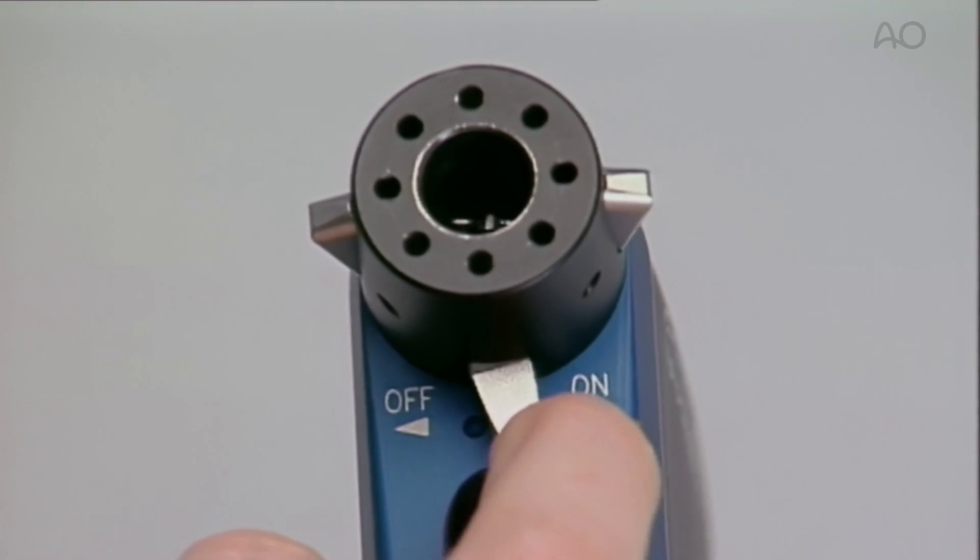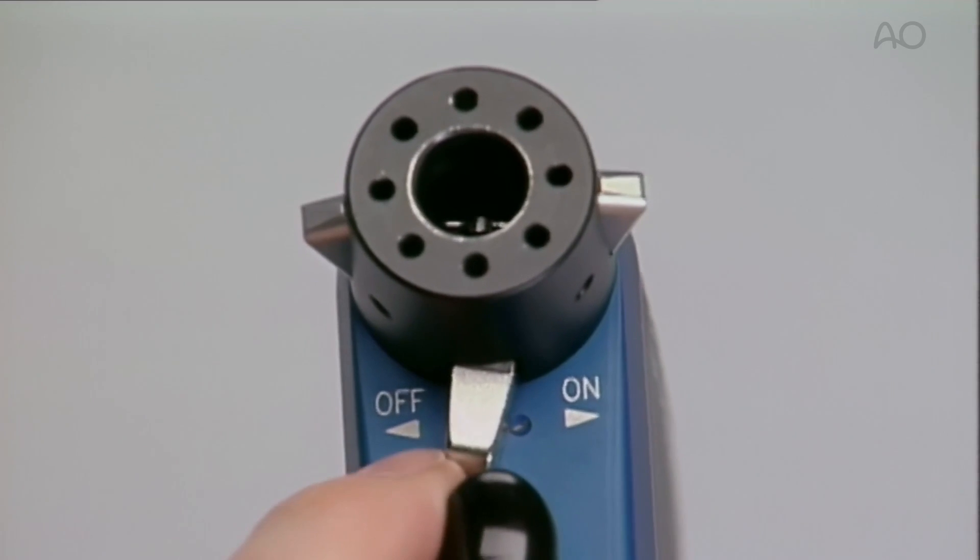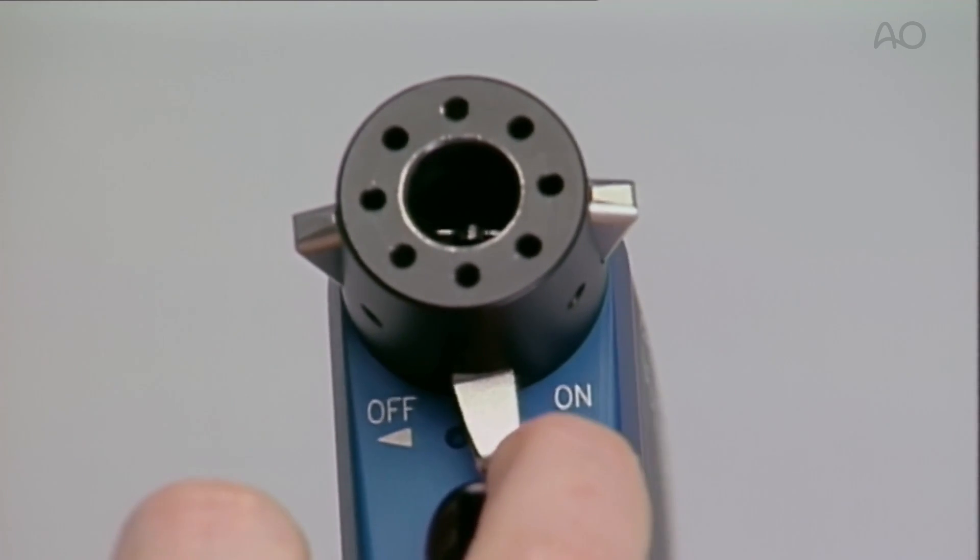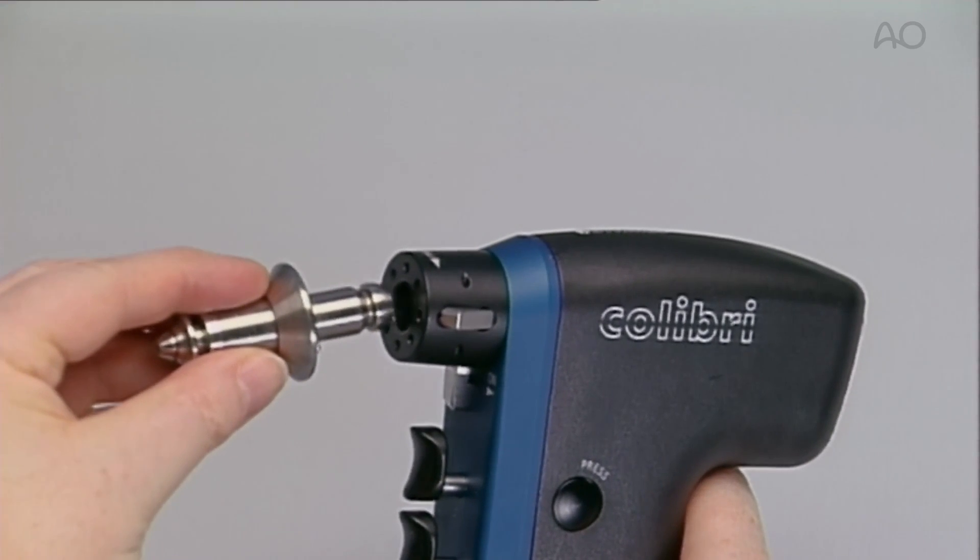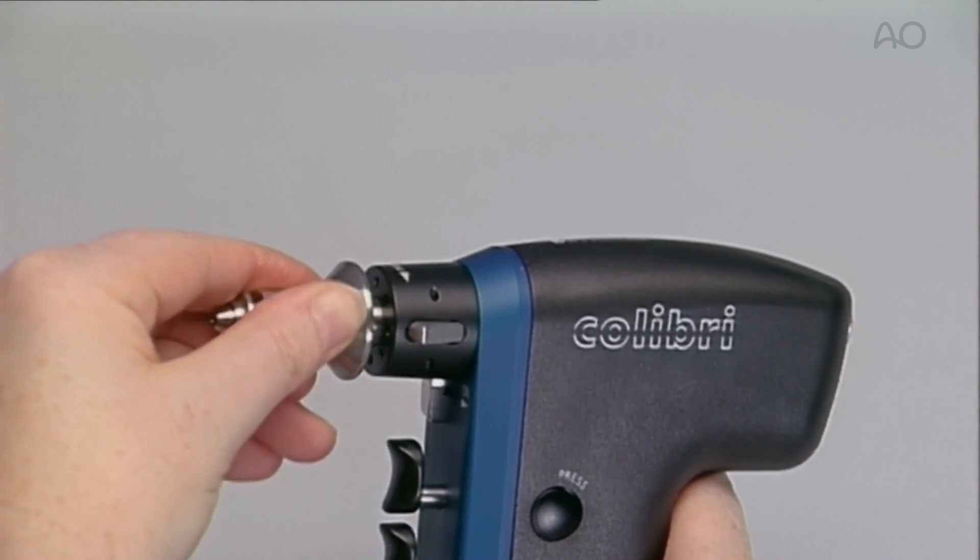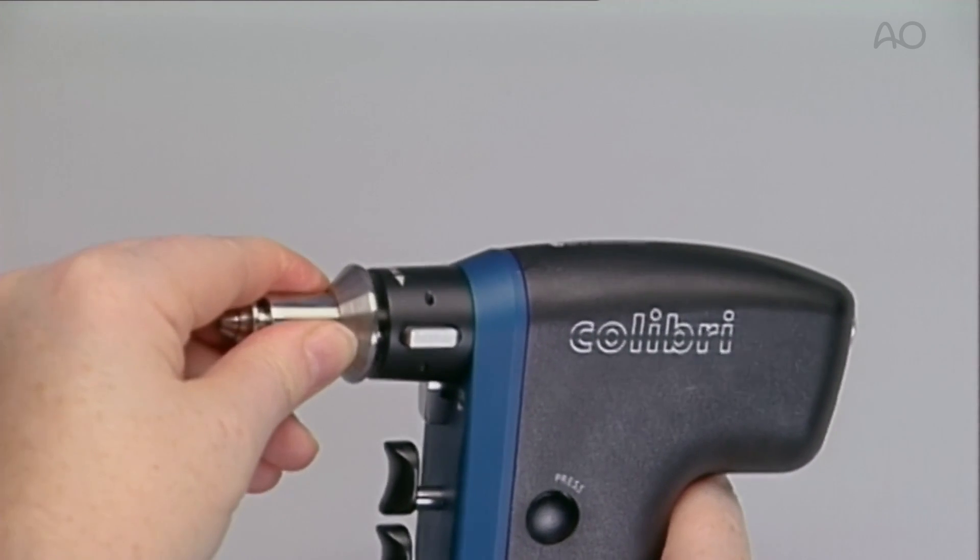The Colibri is equipped with a safety on-off switch, which should always be in the off position when changing attachments or when not in use. The appropriate attachment is inserted and rotated slightly until fully engaged.